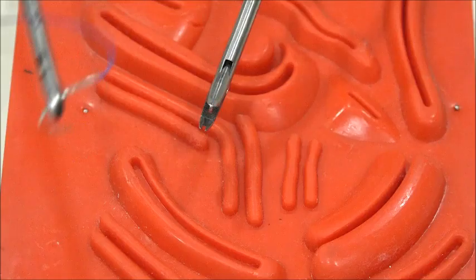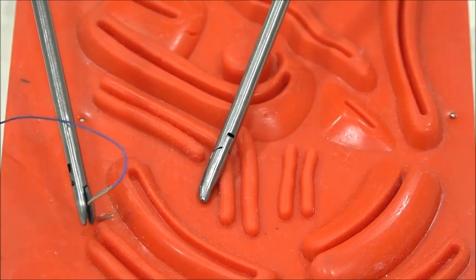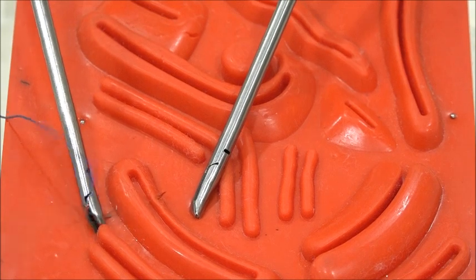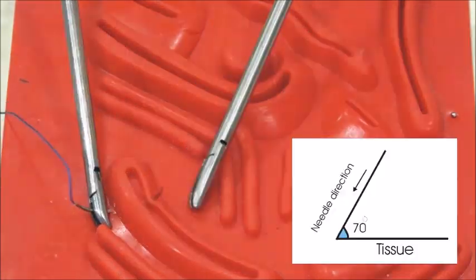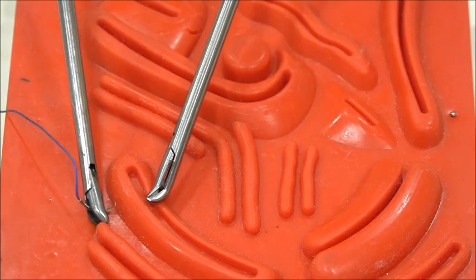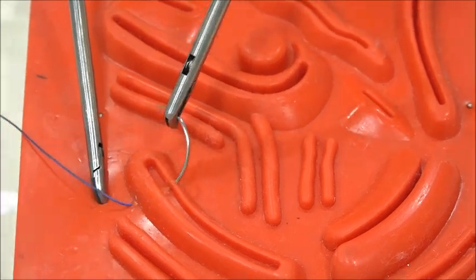Throwing a stitch: we should insert the needle to the tissues at an angle of 70 degrees, and countertraction should be given by the instrument—that is mandatory. With countertraction, everything will become visible as shown in the picture. See how comfortable it is.